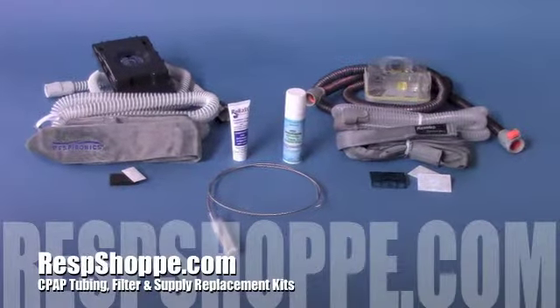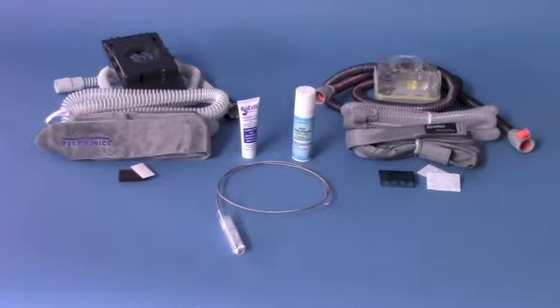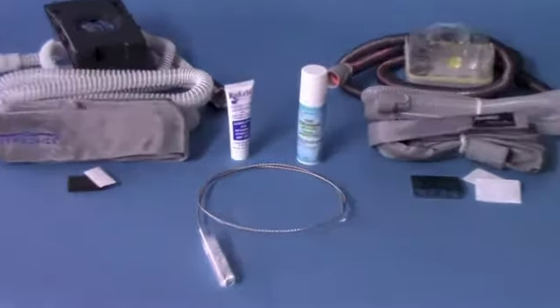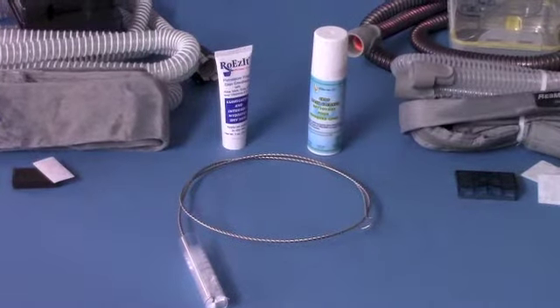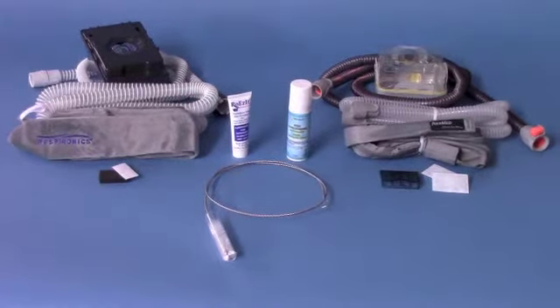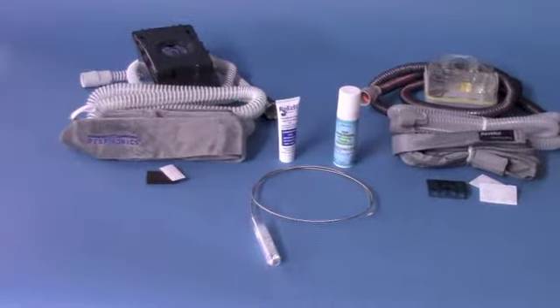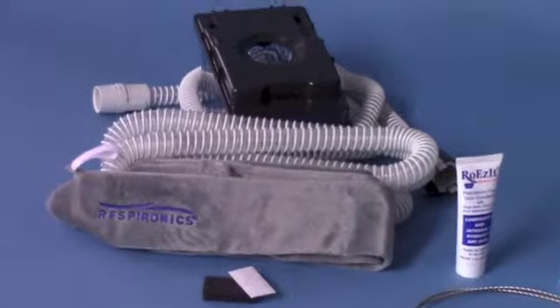New to restshop.com, our all-inclusive CPAP tubing and supply kits provide an easy way for CPAP users to pick up the most commonly replaced supplies, with bonus gifts included for free. Each kit is designed for different CPAP machines, and there are three tiers per kit with different items included. Each tier also includes an additional free gift for savings unmatched at restshop.com.